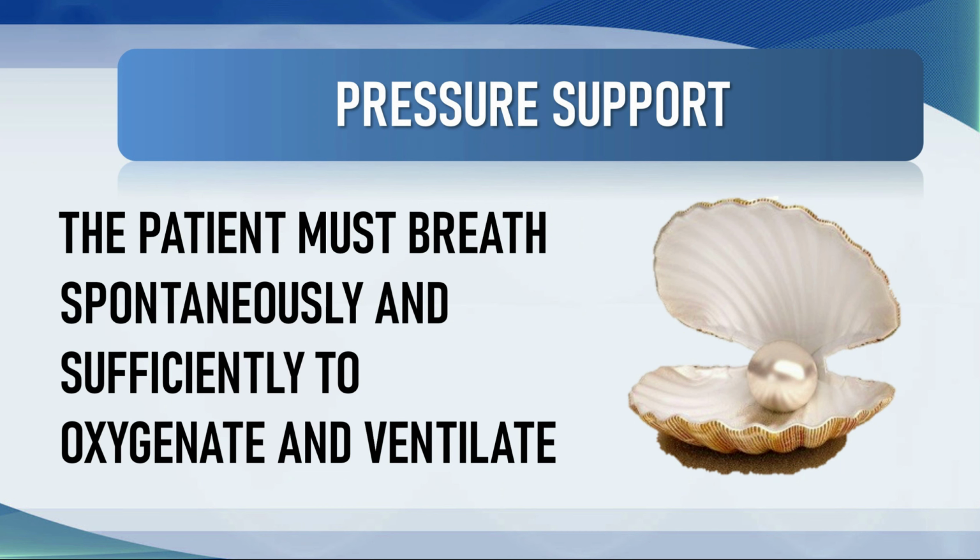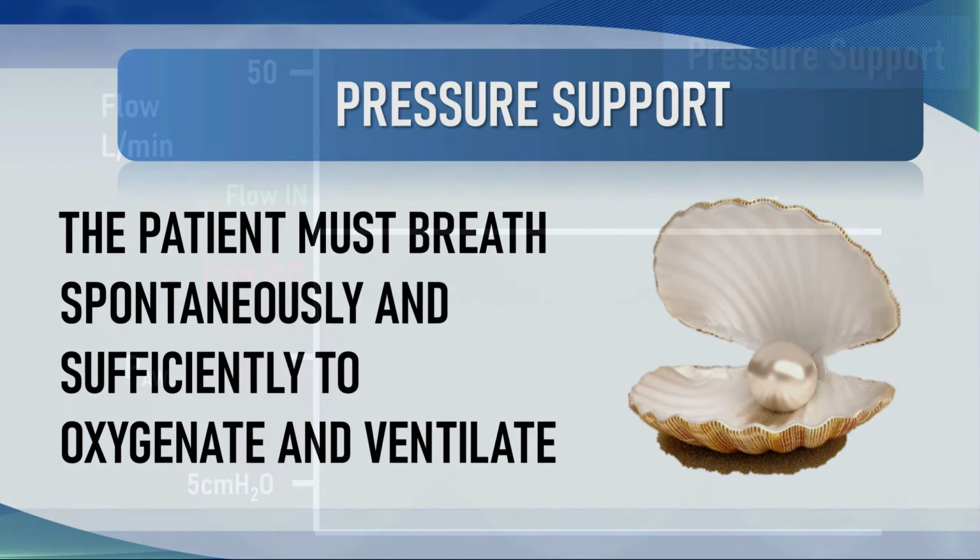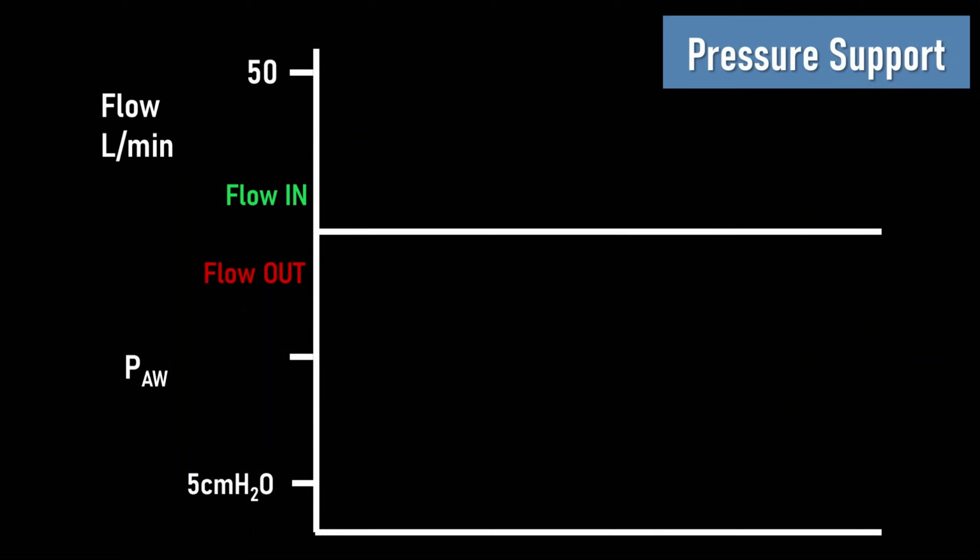A key thing to understand about pressure support is that it is a spontaneous breathing mode. The patient has to be able to initiate the breath. If they cannot breathe to trigger the ventilator and maintain enough flow to ensure that they can oxygenate and ventilate, the patient cannot be on pressure support.